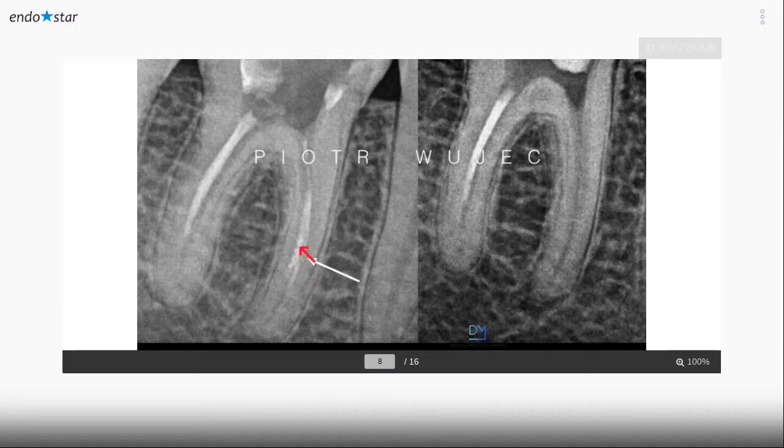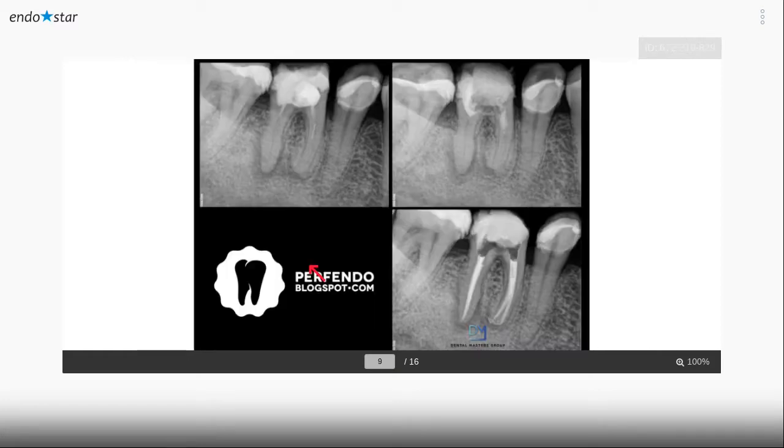It was quite easy, and as you can see here, I did not demolish the mesial root of this tooth, because this broken part is short. It's like 2.5, maybe 3 millimeters. So it can jump out of the canal just with the ultrasonics, because it is quite easy. But when we want to remove a longer instrument, sometimes we need to add some additional tools to the protocol.